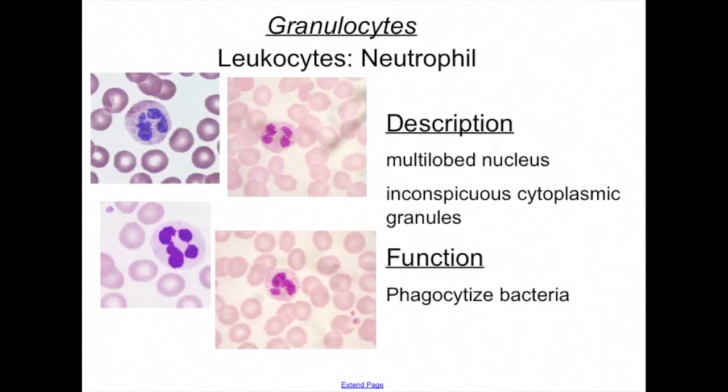On this slide, we will be talking about neutrophils. Neutrophils have a multi-lobed nucleus and account for 50 to 70% of the white blood cell population. Neutrophils are about twice as large as erythrocytes. Neutrophils contain very fine granules. The reason why they are called neutrophils is because they are neutral-loving, because their granules take up both basic and acidic dyes.